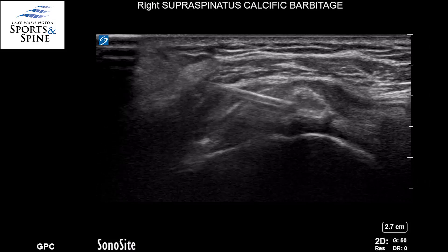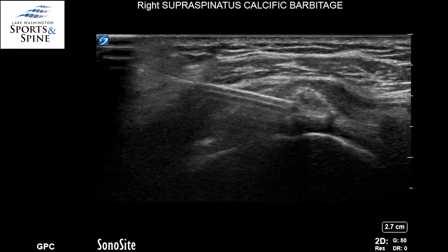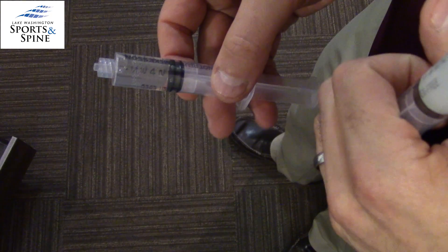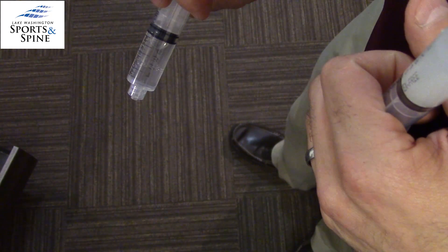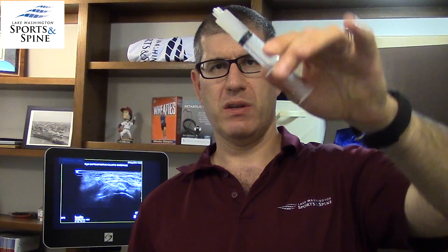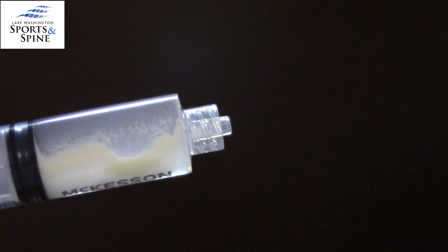Again, we can see the calcium fluid going in and the material pulling out. This is going to be the fluid before we put it in — this is a numbing agent called lidocaine, and you can see it's a very clear liquid. This is going to be the fluid afterwards — it has powdery white calcium deposits that we basically pulled out of that calcific tendon.